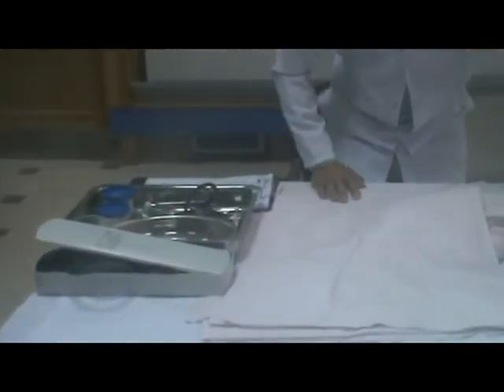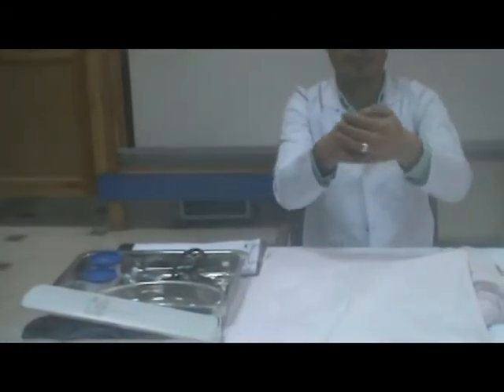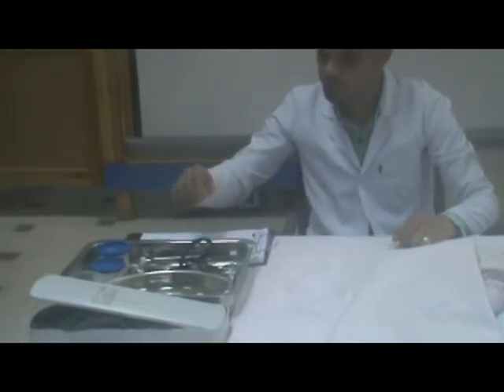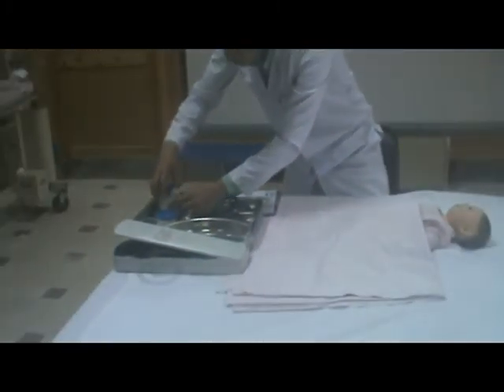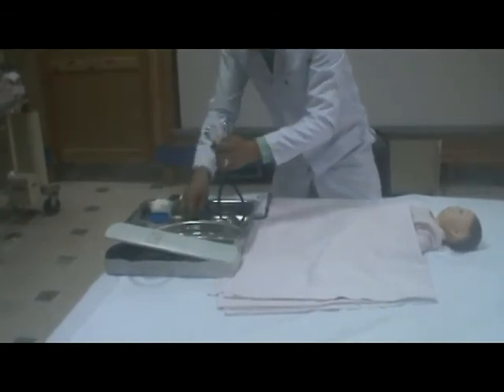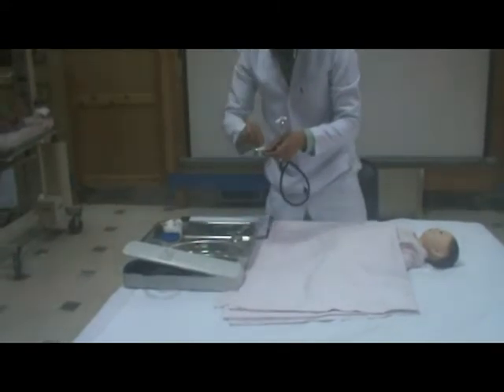Number 4, wash hands to avoid cross-infection. Number 5, clean the stethoscope chest piece with an antiseptic swab before examination to reduce transmission of infection.